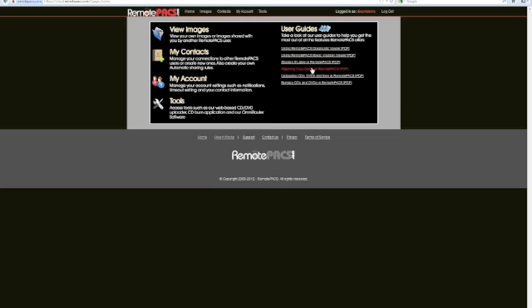Now I wanted to open it up to see if anybody had any questions that were specific to RemotePACS. Let's see here. I think we have one. What is the recommended upload and download speed for an internet connection?